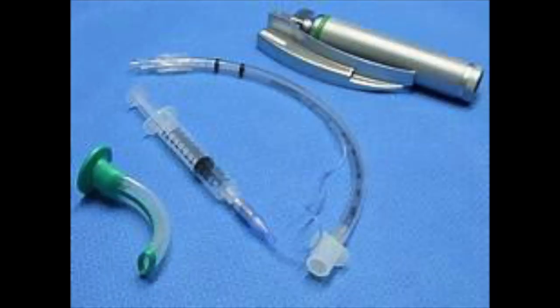So let's go ahead and throw this slide up here. This is just your basic ET tube. And I'm not going to spend a whole lot of time on this, because if I have advanced providers watching this, if you don't know these little things I'm about to tell you, you've got bigger problems. These are basic things. This is more just situational awareness for our BLS folk. There's an ET tube, a laryngoscope with a Mac blade. They have an OPA in there. I don't know why, but that's just an example of an ET tube.